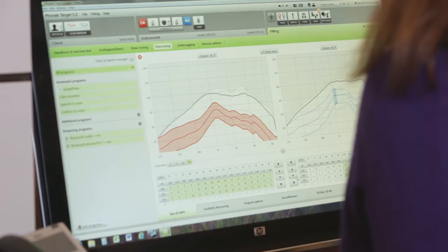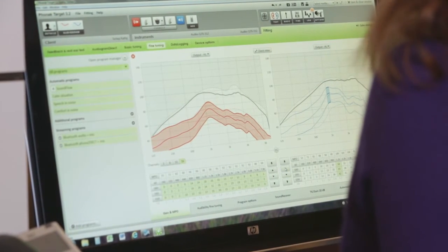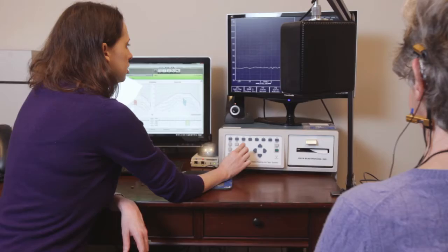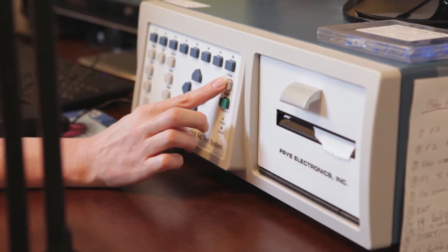We compare that to a target which is based on the patient's hearing levels and a fitting formula. We then look at how close we're meeting the target and then make adjustments to better match that target until we're satisfied that the correct amount of sound is being delivered to the patient's ear.